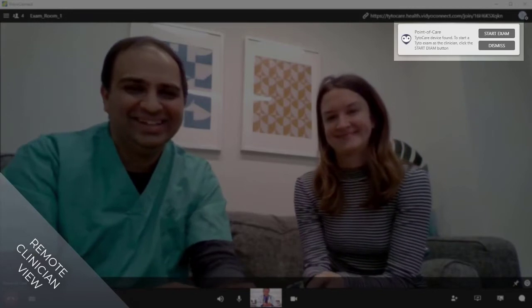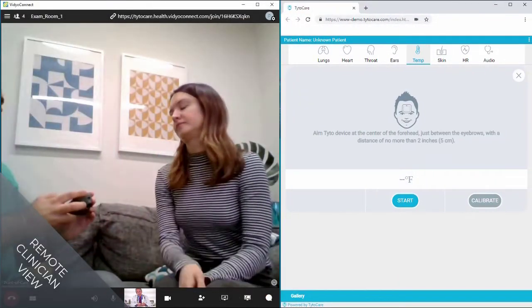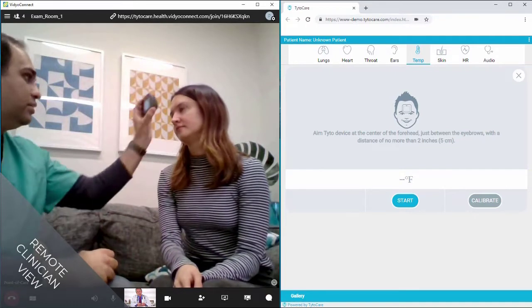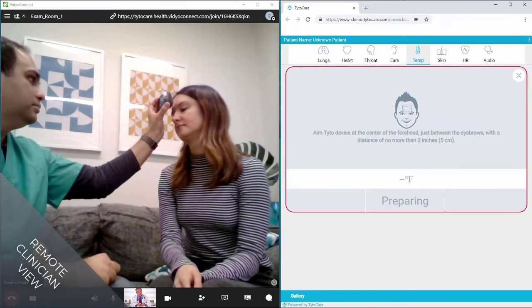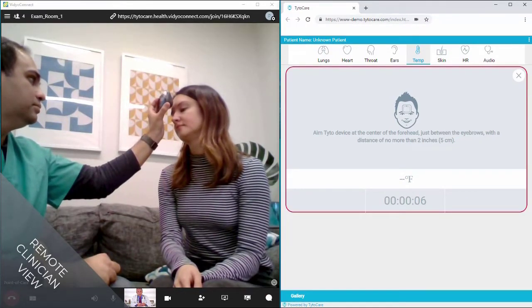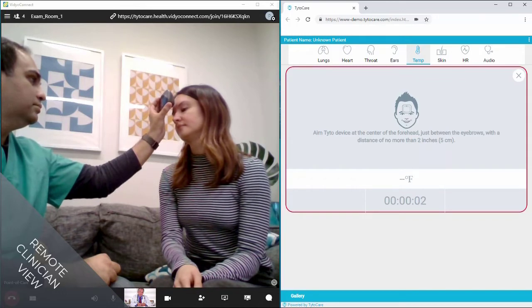The clinician is notified of the paired Tytocare device and can click to launch the remote Tytocare exam. From here, the remote clinician can execute clinical examinations with the all-in-one Tytocare device while continuing the high-quality video interaction with the point-of-care provider.